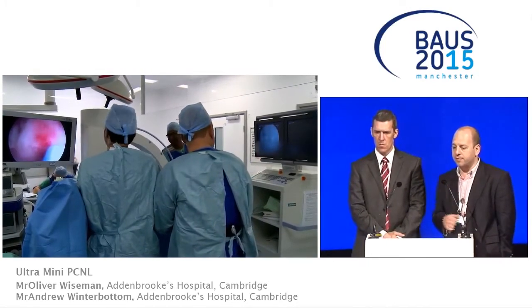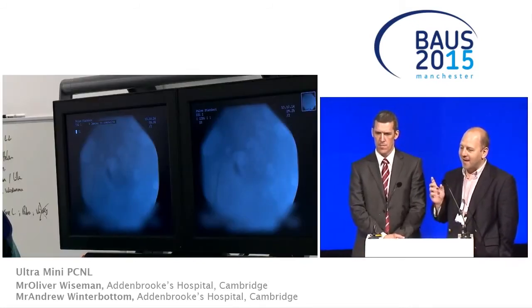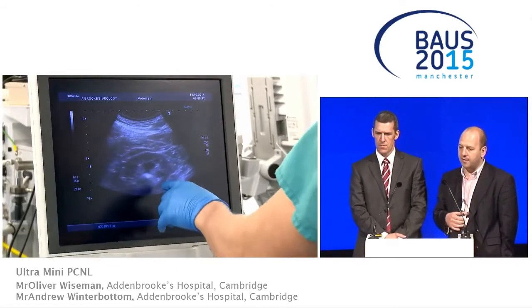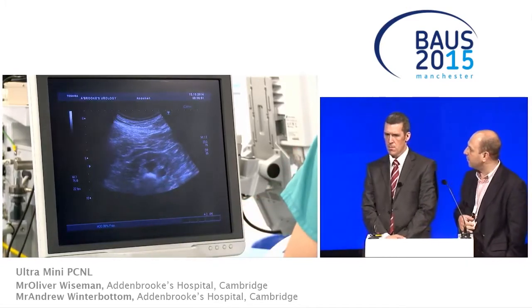We had a few problems doing that, actually. It was the hardest part of the case. We use a little J wire to help us get up. We've got the retrograde catheter up into the kidney, as you can see. Turn the patient prone. I'll hand over to Andy to take you through the puncture.